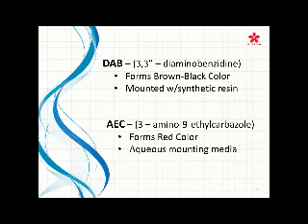So many times, your S100, Melan-A, MART1, and HMB45 will be done using the AEC. Also going into dual stains, and dual stains are becoming a very common part of immunohistochemistry these days, where we're doing multiple antibodies on one tissue section. You're using two separate visualization kits to detect these antibodies on one tissue section.